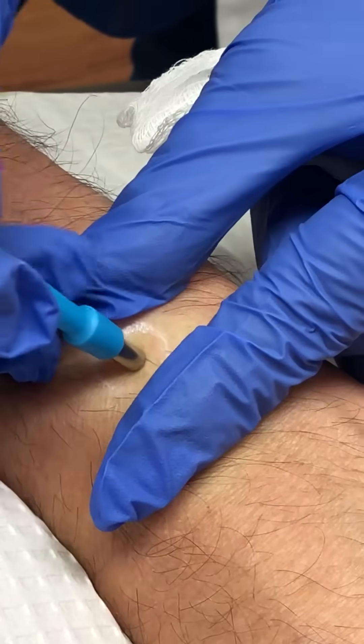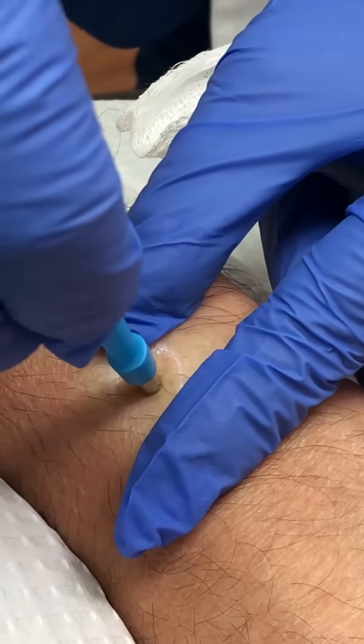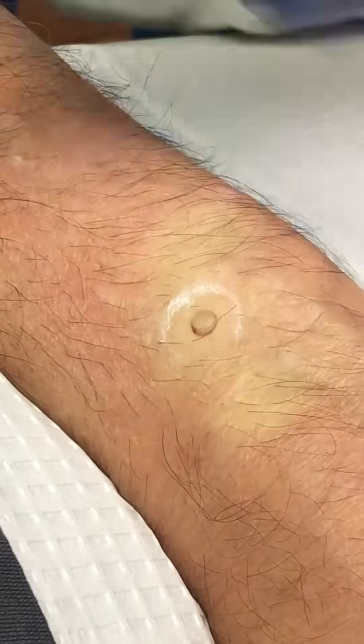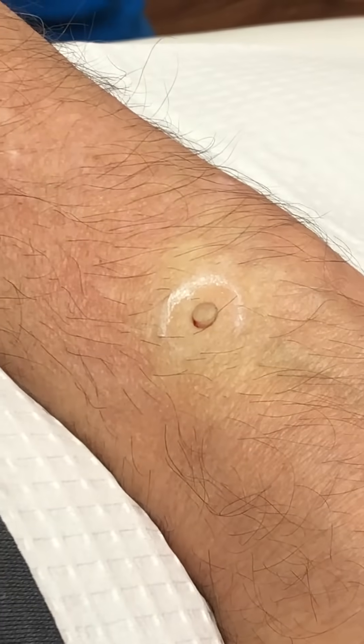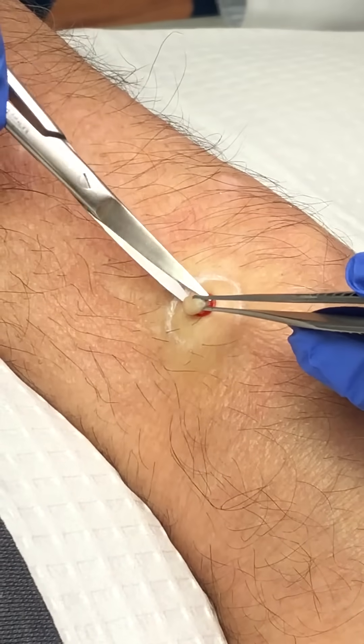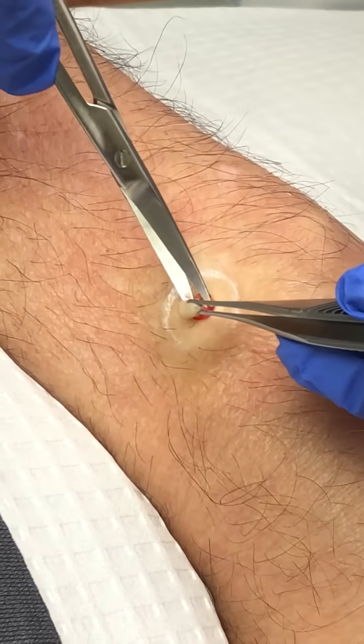We use the biopsy just like a cookie cutter and it's just turned back and forth. Okay, we're lucky today — you're not bleeding that much. And I use a little forcep, pull up the biopsy, and I can actually see it's a little cyst.